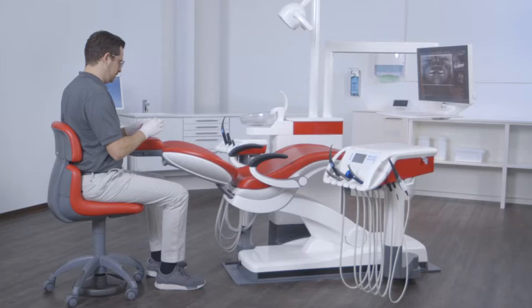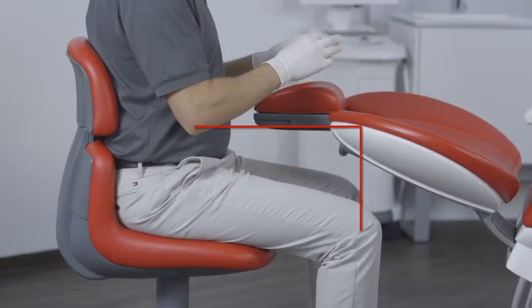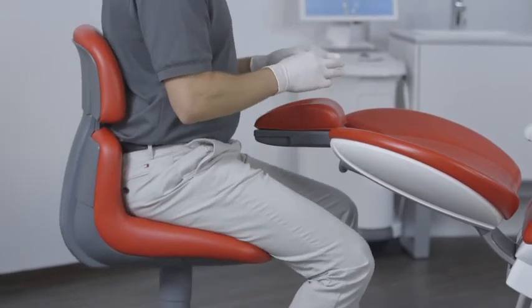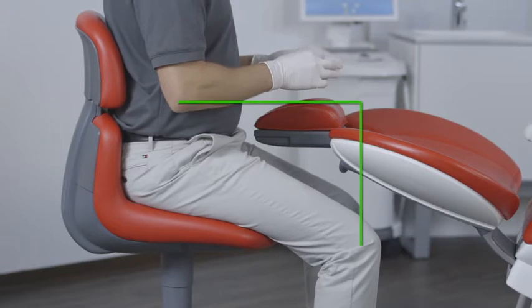In this video, we show you how to carry out ergonomic treatment with Xenius. The seat height is key for the correct working position. The first rule of ergonomics is to create as much free space as possible between the dentist's hands and knees. There must be sufficient space for the patient's torso and the backrest.